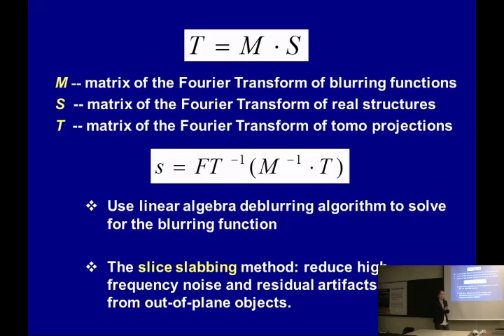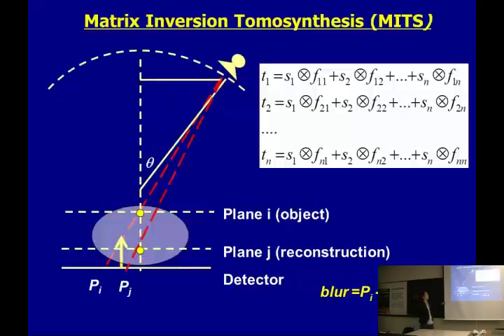So you make a tensor product for all the image pixels there? What do you mean, tensor? I saw you have some tensor multiplication. This one? No, the top circle, the circled times sign. This one? Convolution. Just traditional convolution. Yes, convolution.